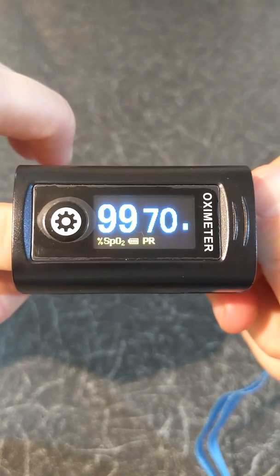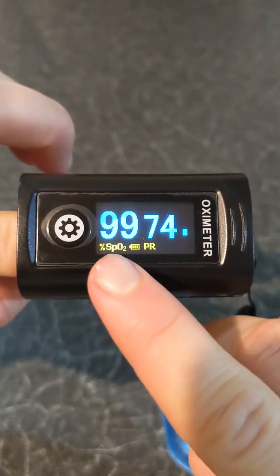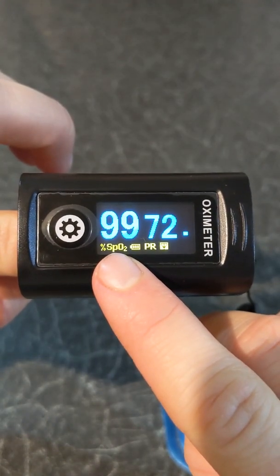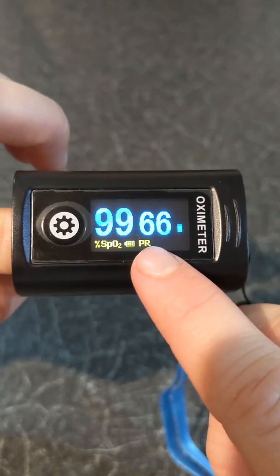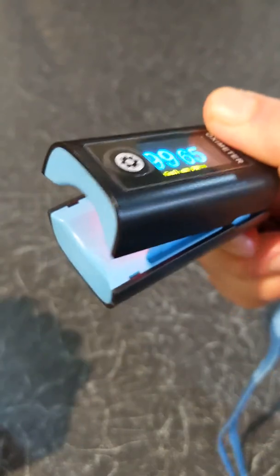The oximeter will display your oxygen level above where it says SpO2, and it will display your pulse rate above PR. Once your finger is out, the oximeter will shut down automatically.